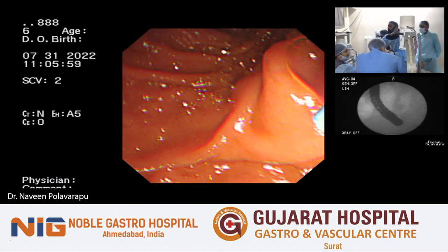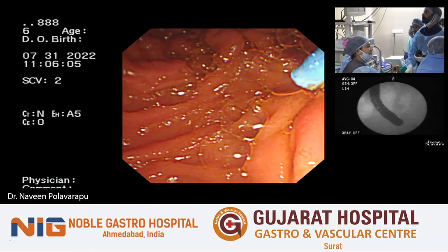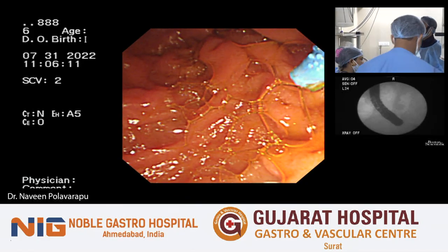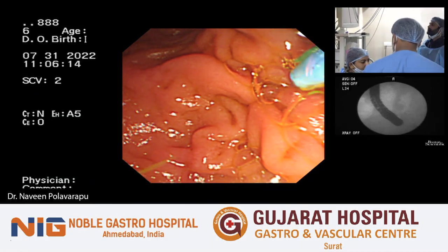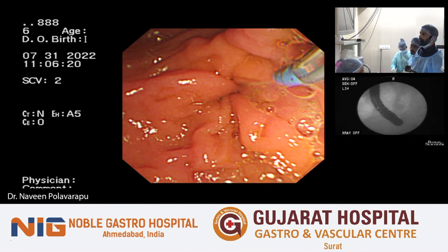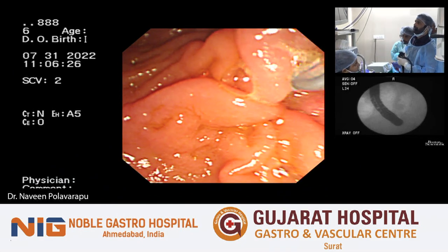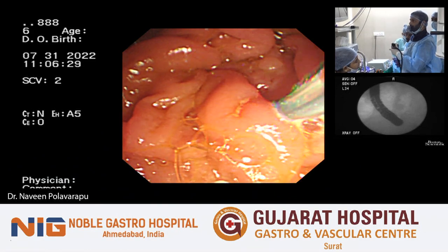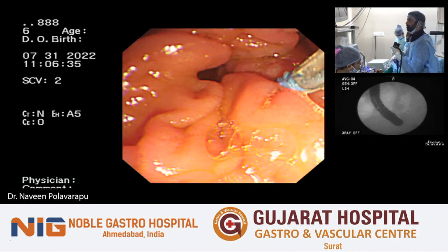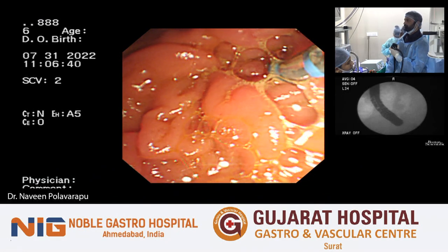I just had a little comment on the previous question about intrahepatic stones. I think these can be challenging. It depends on the anatomy where the stone is. Ultimately, SpyScope is excellent with mobility, but compared to a regular endoscope, the angle the Spy tip moves is lesser. So sometimes when stones are really at the 6 o'clock position, deep, it can be very difficult to get access to those stones. However, with some maneuvering and effort, we've been able to achieve it successfully. We have had about 4 patients in which we've done it successfully. We haven't had to send anyone for surgery, but it was more challenging than a standard case.